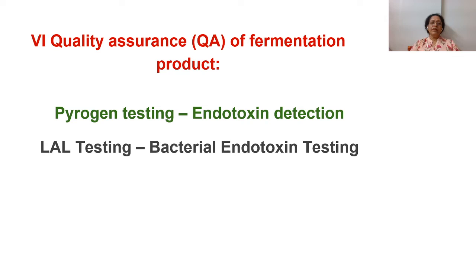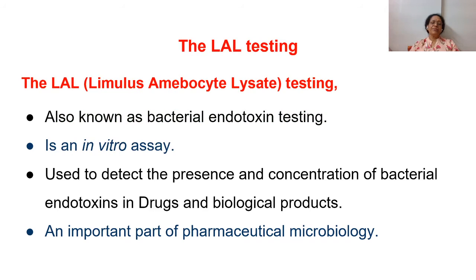This one is for the LAL test. About this LAL testing, this is also called a limulus amoebocyte lysate testing, and the test is mainly used for detection of endotoxins.